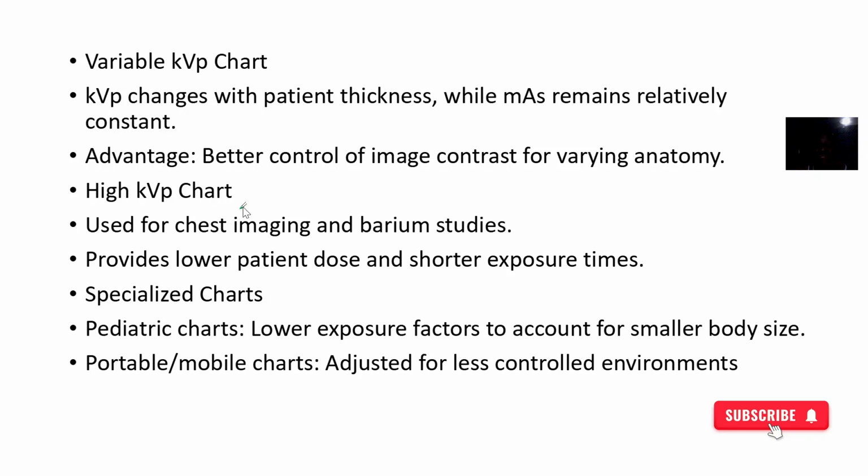Then we have the high kVp charts, used for chest imaging and barium studies. Then we have specialized charts, which are applied when you are dealing with pediatric patients. They also apply when you are dealing with elderly patients, depending solely on the patient's condition.